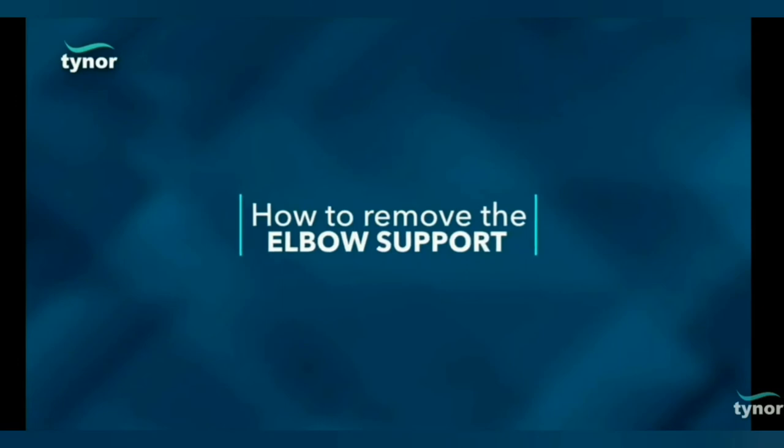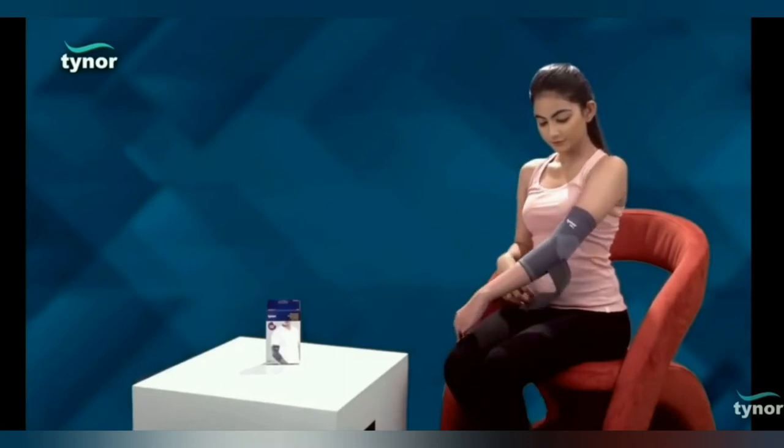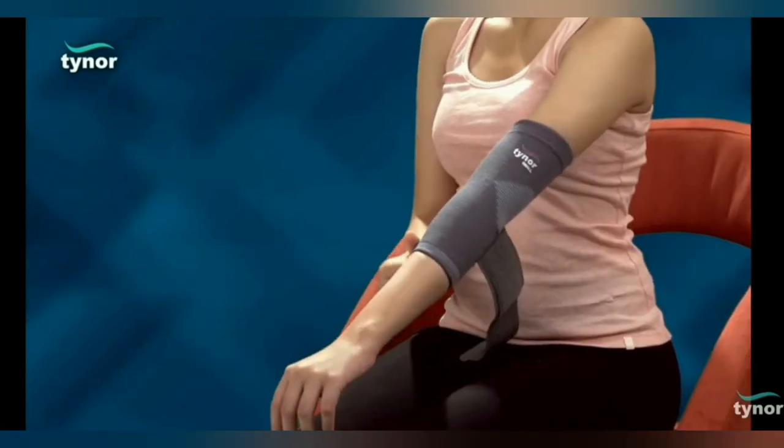Now, let us see how to remove the elbow support. Unfasten the Velcro strap and simply pull down the product from the arm.